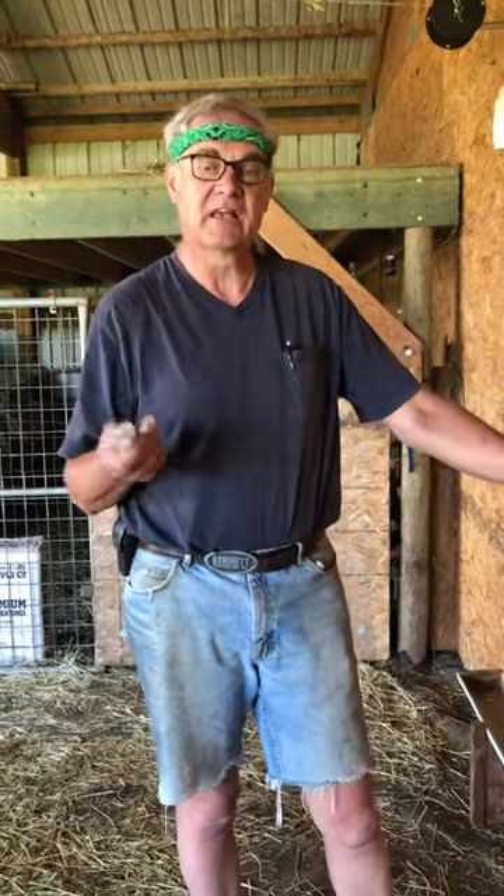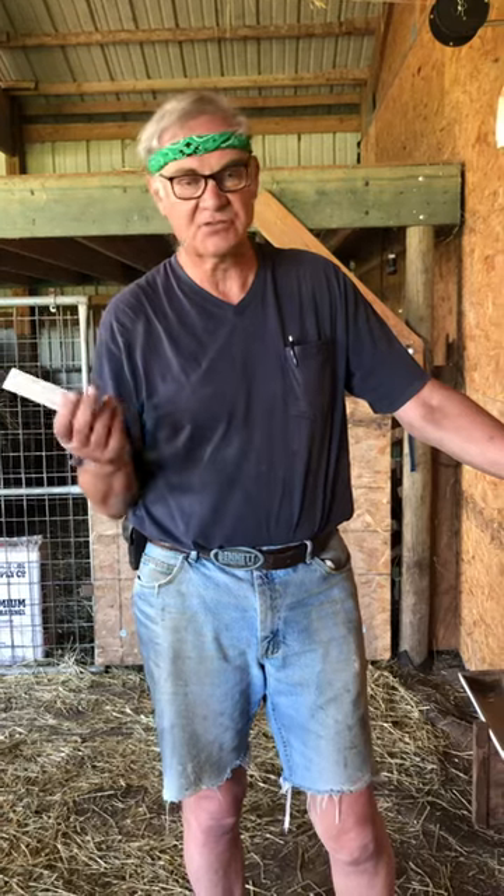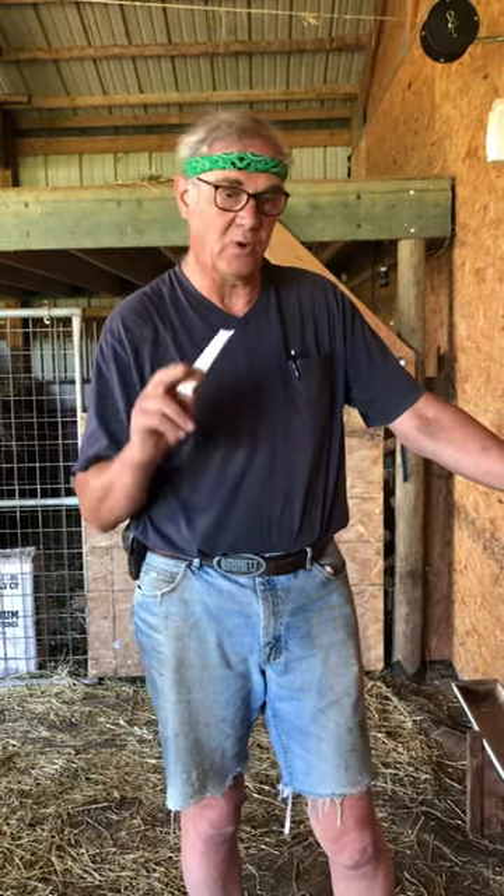Hi, I'm Eldon, Topham Creek Alpacas. A lot of folks have questions about how to do SQ injections, so I'm just going to walk you through one of those.